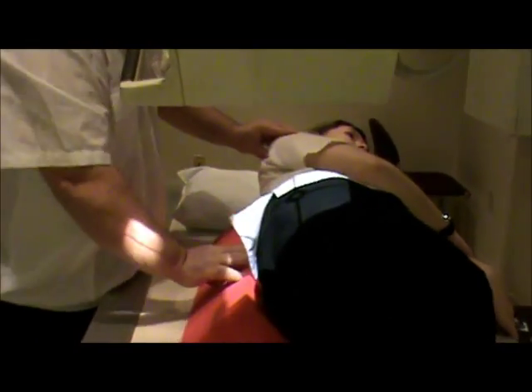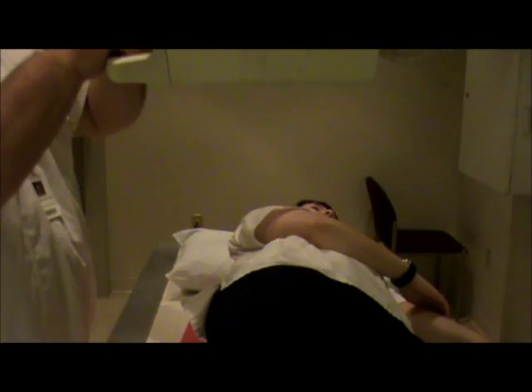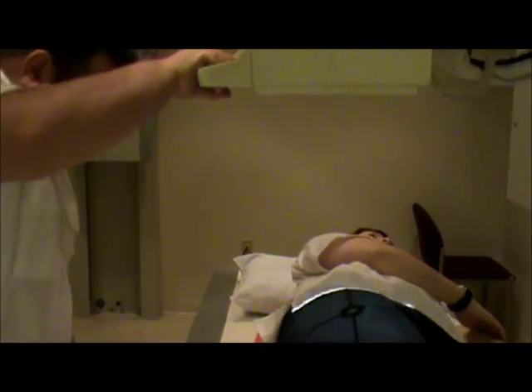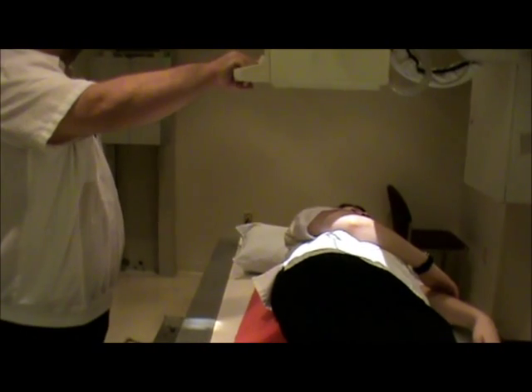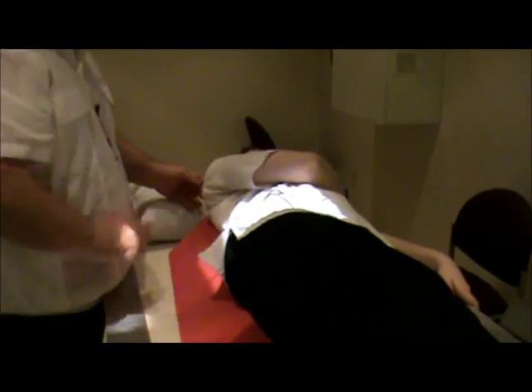We'll use the sponge and have the patient roll up a little bit to the left side. I'm going to look at the hips and the shoulder. I'm going to roll her back since it's only 25 to 30 degrees. I do need to take my tube angle off, because there is no angle for this oblique. And I must re-center. We'll bring her out for you just a little bit.